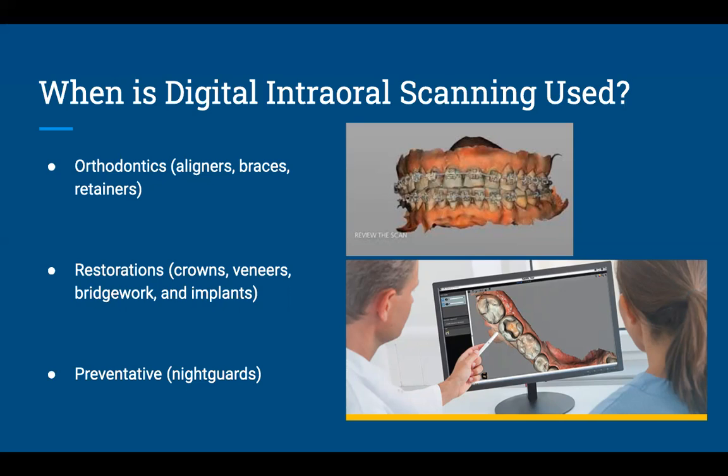Yes. And additionally, it is very useful in dental hygiene. For example, it's great to progress and track the dentition of a patient. And also, if the clinician, the dental hygienist, has extra time, he or she can see flattened incisal edges, and noting that, instead of asking the doctor who's busy, they can just go ahead and scan, in case they are in need of a night guard. So it helps with time efficiency as well in dental hygiene.